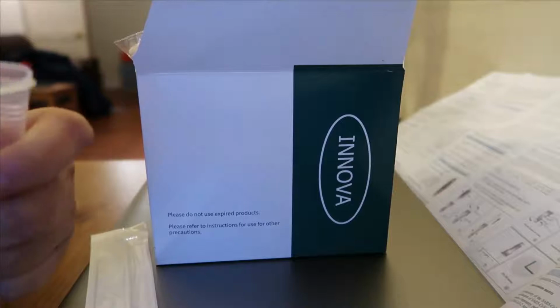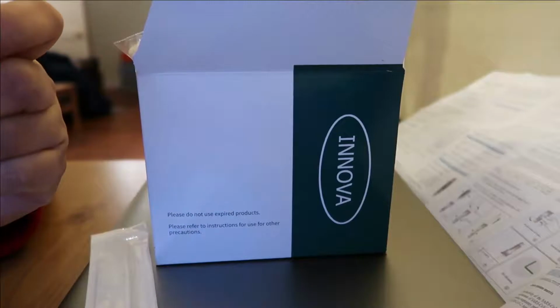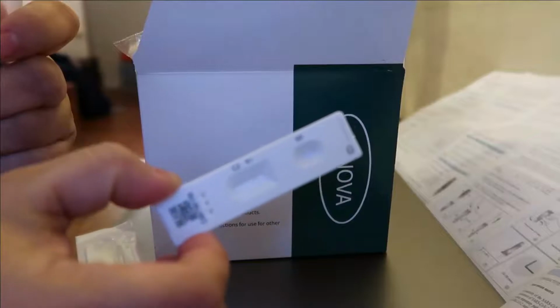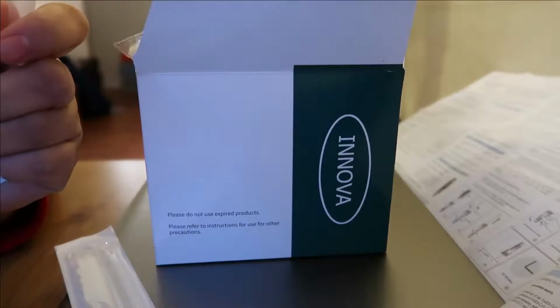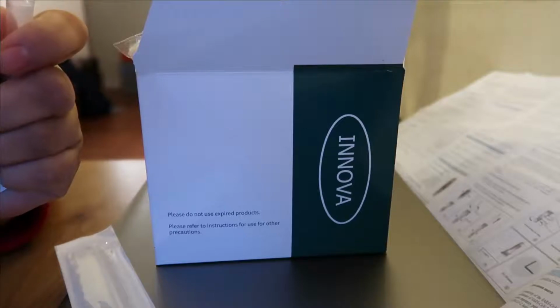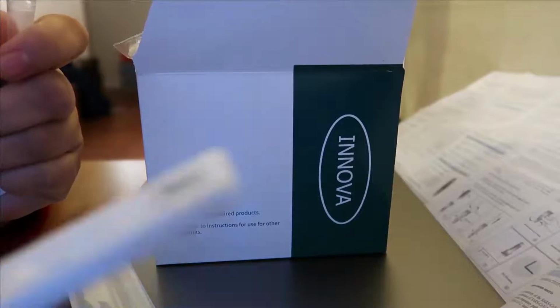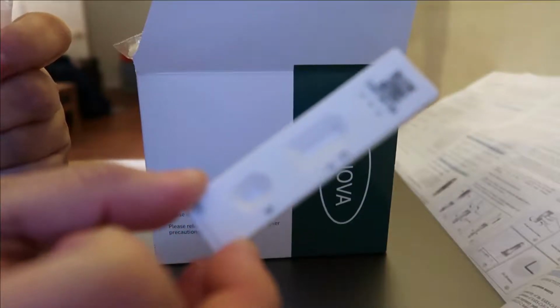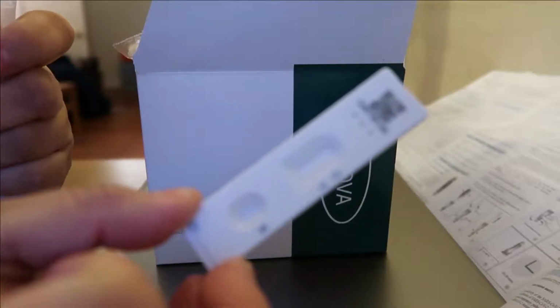So as much as possible, I won't touch any part of it except for this side. It looks like a pregnancy test, just like what I said to you. Oh, does it focus? Okay, it has a C, T, and S. That means where the S is, you put the specimen. Can you see it? Oh, I'm so sorry. The one near my hand is the S, where I need to put my specimen later.